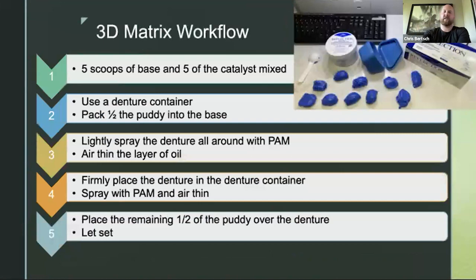So yeah, that's the workflow there. Kind of everything I already went through. And then once it's set up, give the patient their denture back, and then they're good to go.